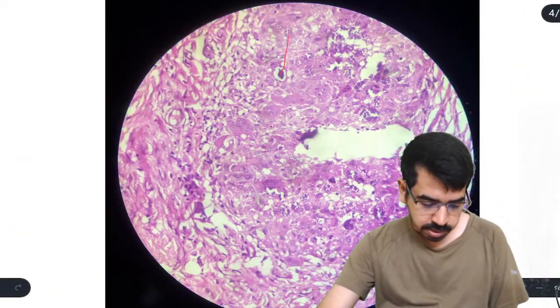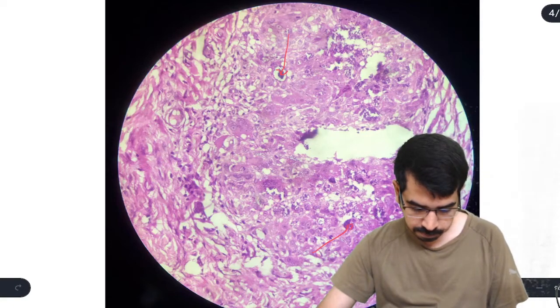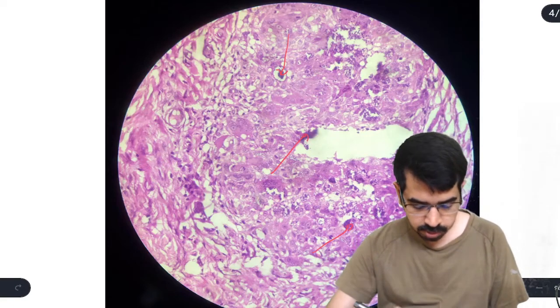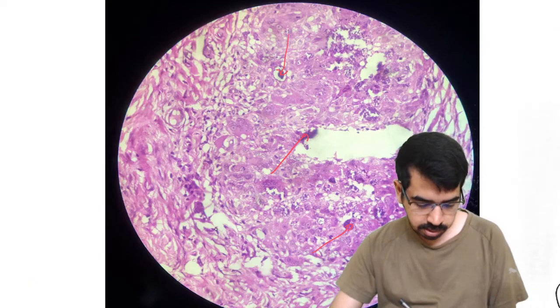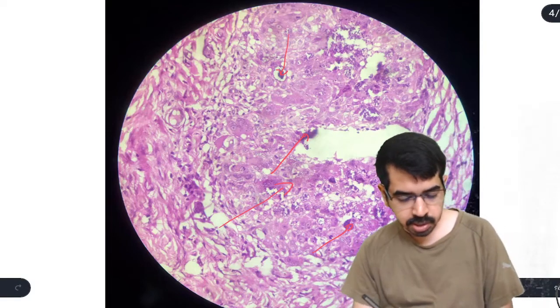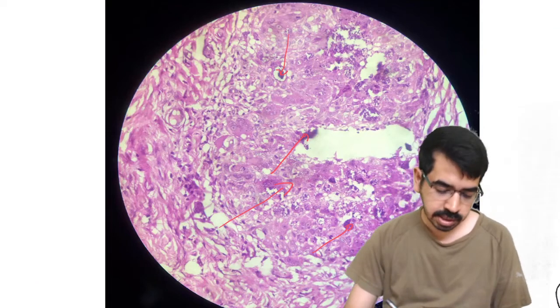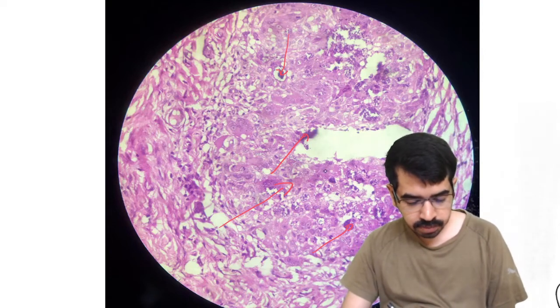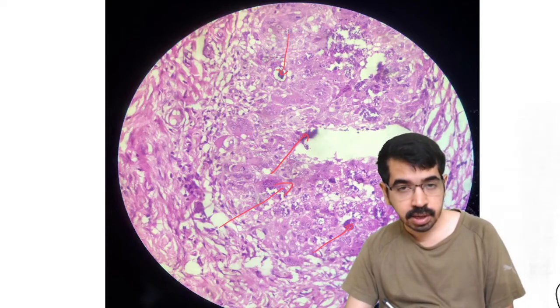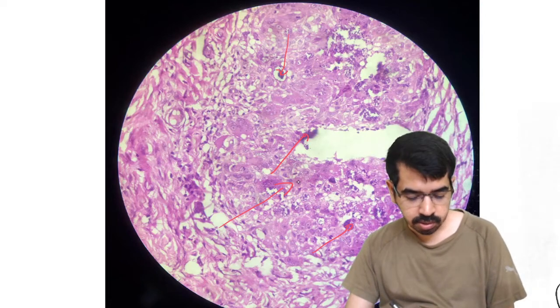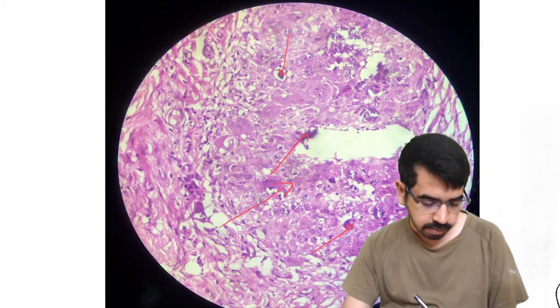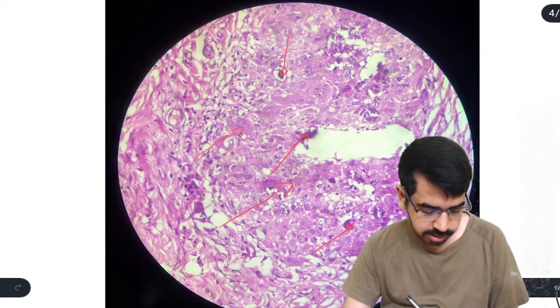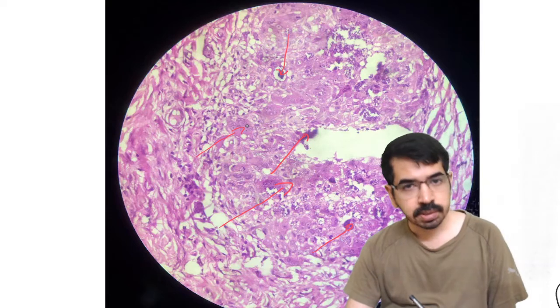Some of these basophilic deposits are surrounded by cells with abundant eosinophilic cytoplasm and distinct cell borders — these cells are histiocytes, epithelioid histiocytes. We can also see some foreign body giant cells with many nuclei scattered in the cytoplasm.